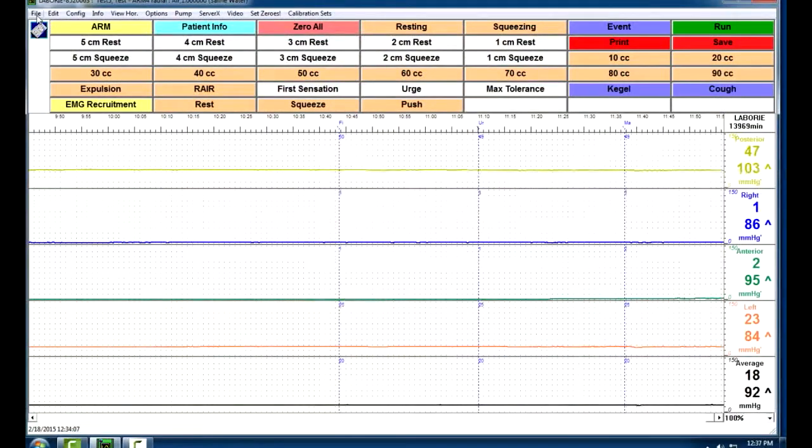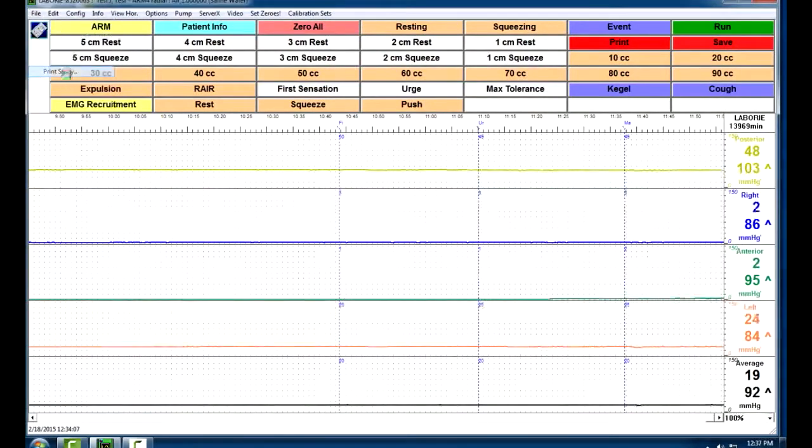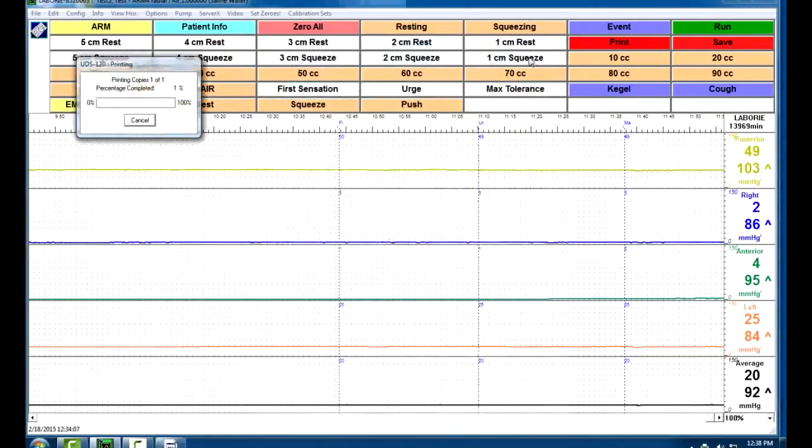Next, we'll go ahead and print the report. We're going to go up to File, Print Study. We're going to do a UDS report, even though it is an ARM report. We'll click Graph Pages and Report Pages. We'll click the ARM events down at the bottom, removing Event Summary and URA. Then we click OK, and the report will print.